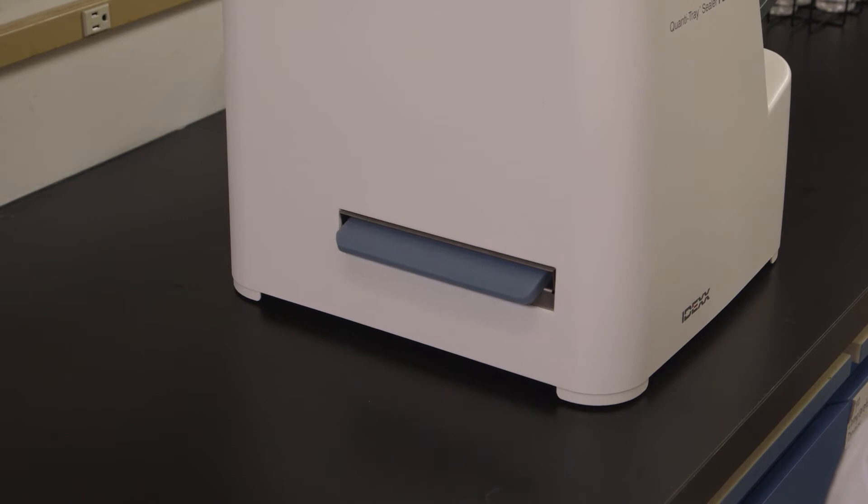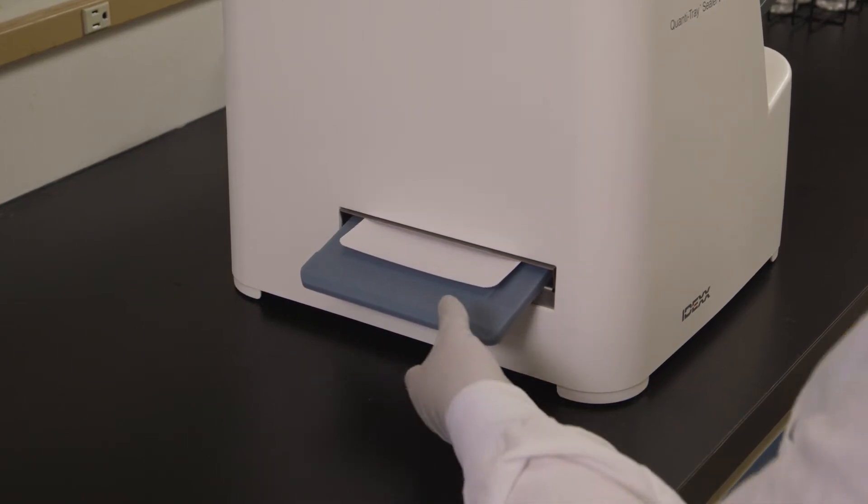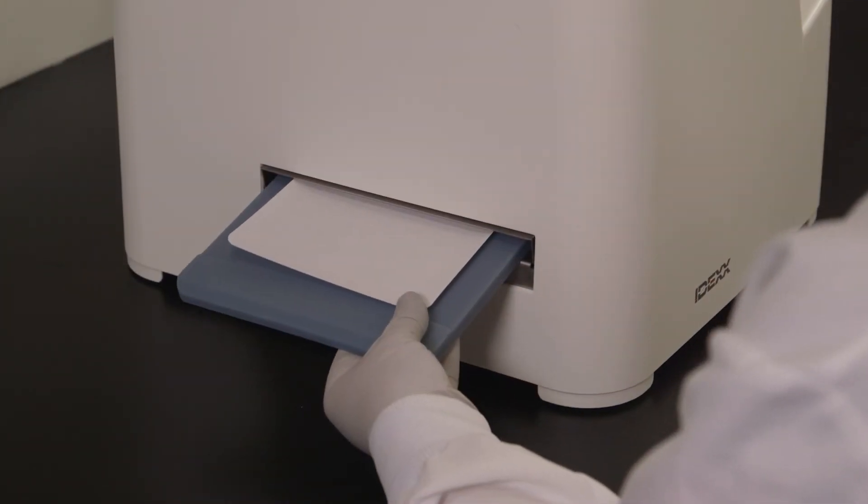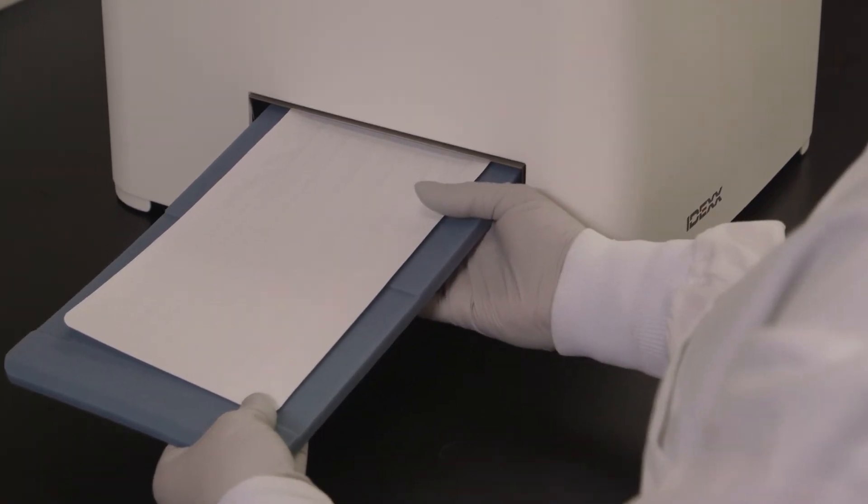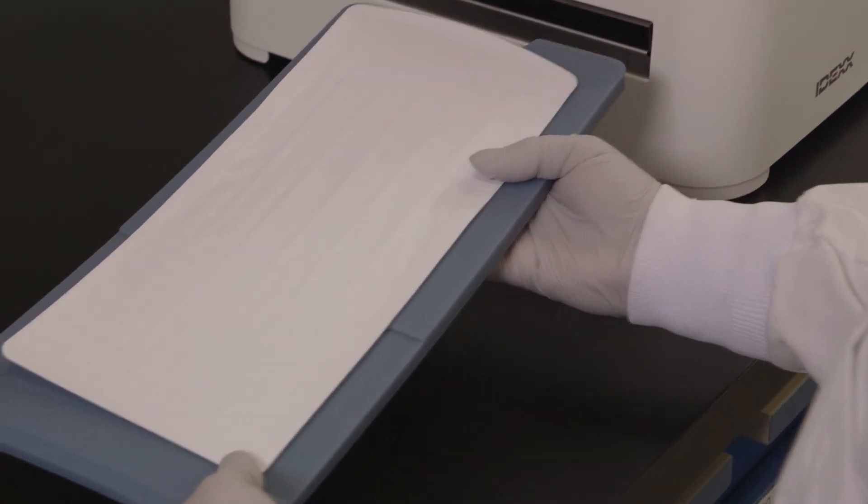The sealer distributes the sample mixture into the Quantitray LEG-ALERT wells, seals the wells, and partially ejects the sealed tray. Remove the rubber insert and tray from the sealer.